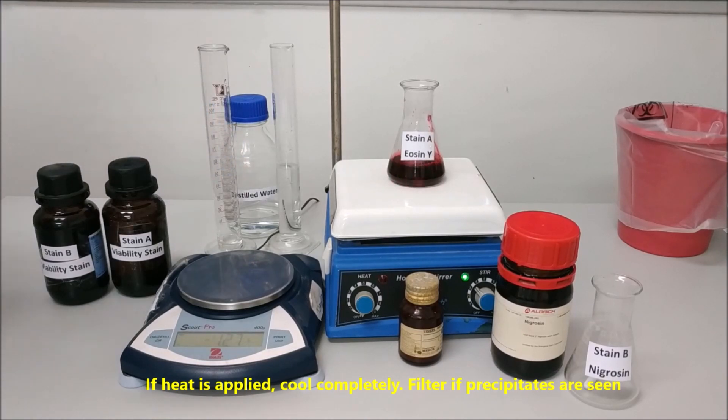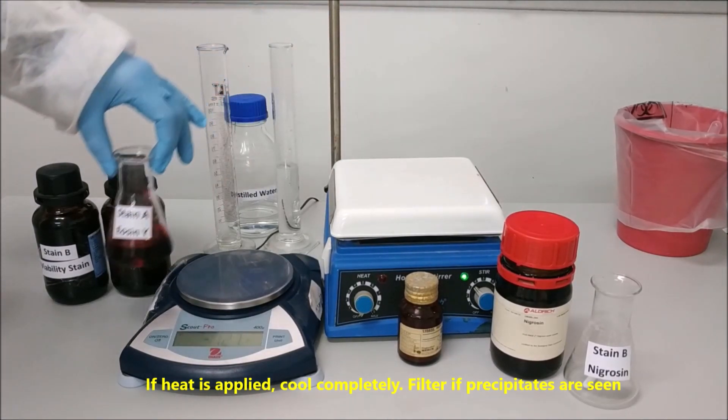If heat is applied, allow to cool completely. Filter if precipitates are seen.